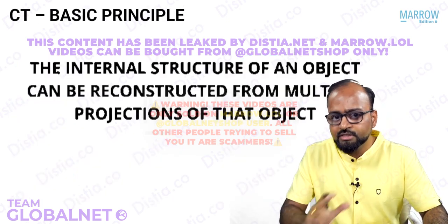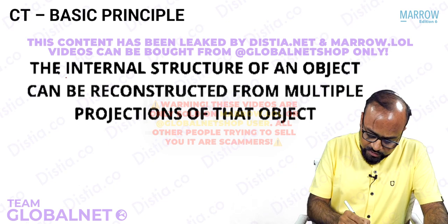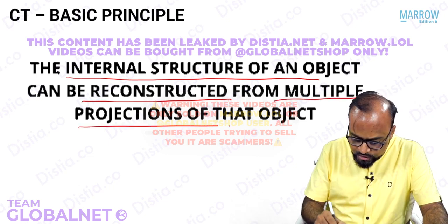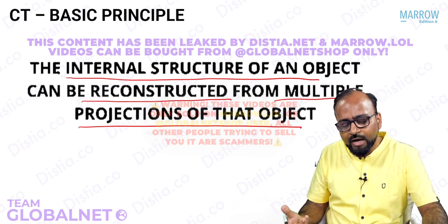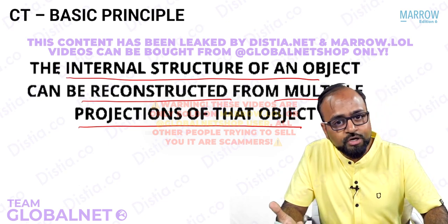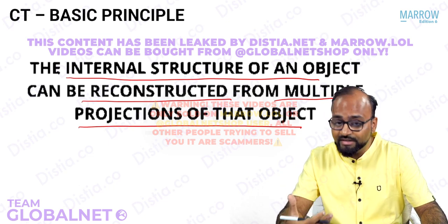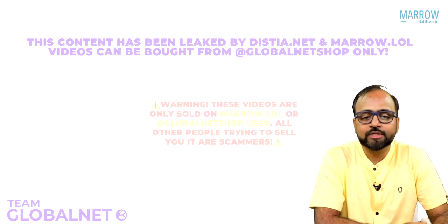Now, what is the basic principle of a CT scan? The basic principle of CT scan states that the internal structure of an object can be reconstructed from multiple projections of that particular object. Does it make any sense to you right now? I'm sure this big line, whatever I've read out and underlined here, does not make any sense to you right now. But that's okay, because now we are going to jump into the CT scan animation. And in this animation, you'll very beautifully understand what this sentence actually means and what is the basic principle of CT scan.